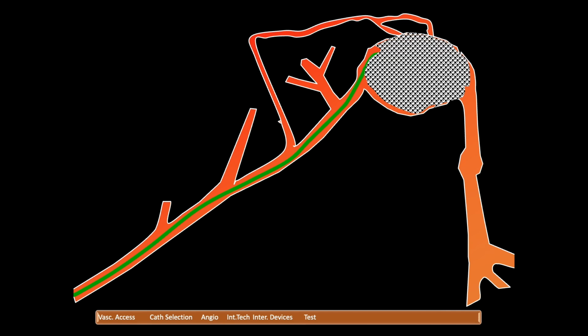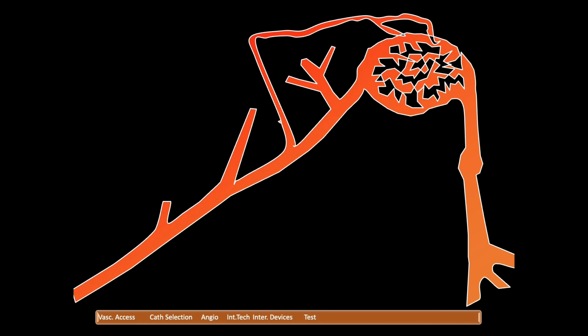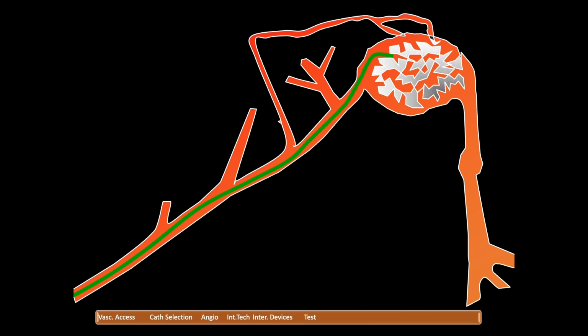So you can block it. We can get inside the nidus of the AVM with a microwire, and over the microwire you get into the nidus with a microcatheter, and then inject particulate agents as you do in tumor blood supplies, where you want to devascularize, or completely devascularize sufficiently, depending on whatever you like. Whereas when you want to use the other one, like NBCA liquid agent, NBCA is normally liquid, but when it comes in contact with ionic solutions like blood, it will start solidifying.